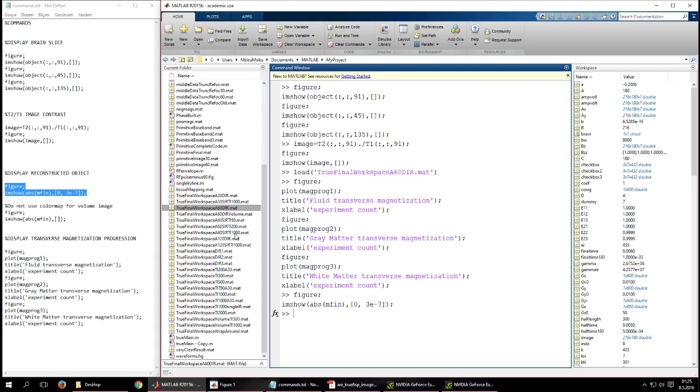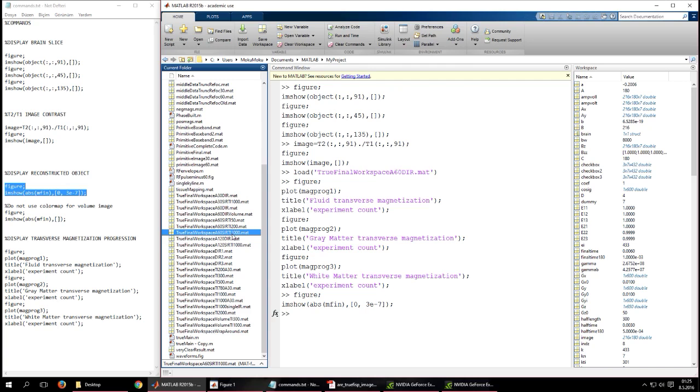The next demonstration is from a simulation which, again, plus minus 60-degree excitation pulses are used, but this time single inversion recovery is used and the inversion time is 1 second. We'll see that the image will be drastically affected.